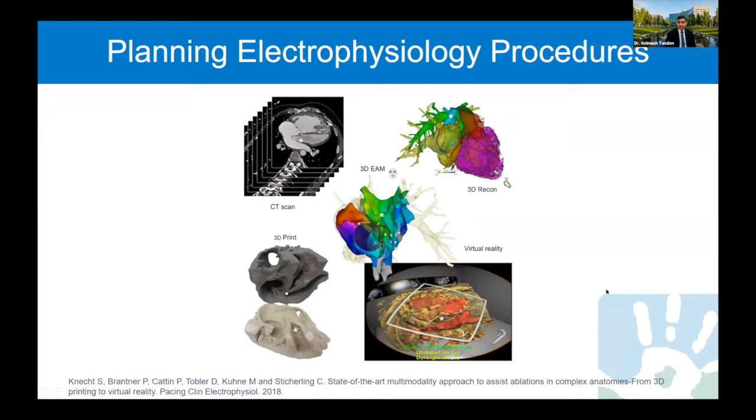And this team suggested that the 3D print allows a real size assessment of the geometry and even allows inserting the medical device to predict possible anatomic challenges about where the catheter might get stuck in this patient with an atrial switch procedure.